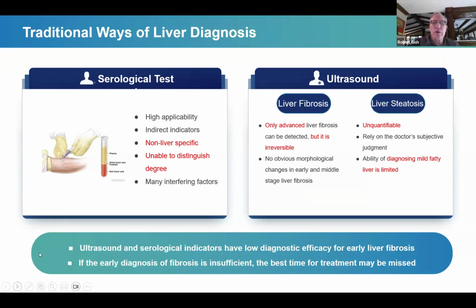Ultrasound does help you also to stage. It gives hints about fibrosis and fatty change. You can measure the spleen size and portal vein diameter. Those are definitely quantifiable on ultrasound, and I strongly recommend that you measure spleen diameter and spleen size in every patient.